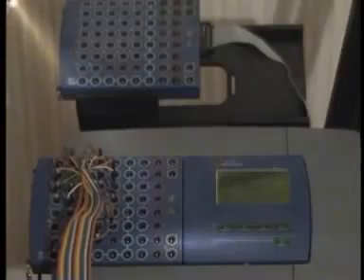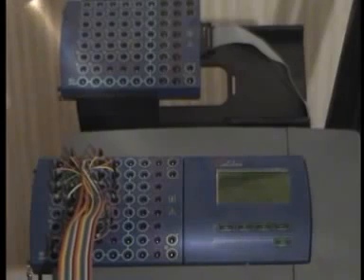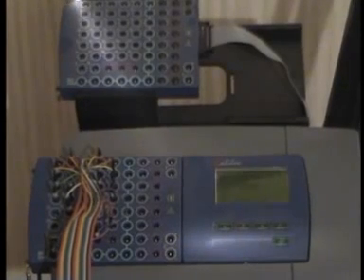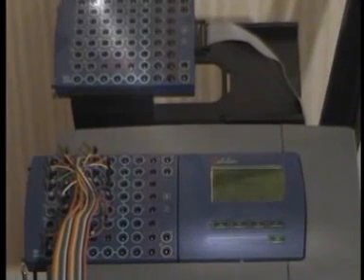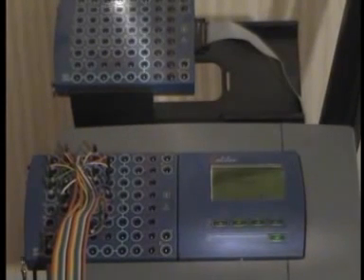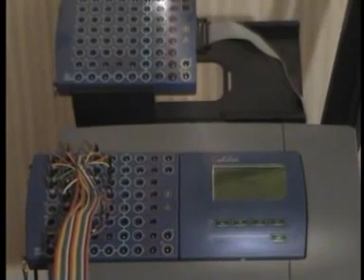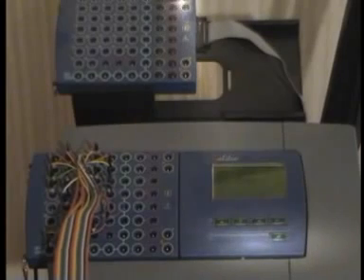Connecting the COMBY EEG cap to the EEG machine. When the EEG machine has a 25-pin connector on the headbox, the COMBY cap is connected directly. If the machine does not have the 25-pin connector, the cap is connected using an adapter cable.